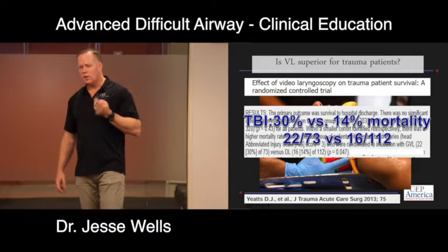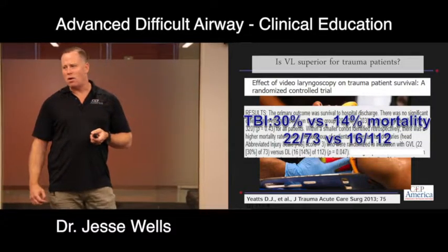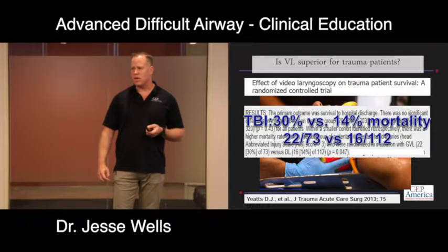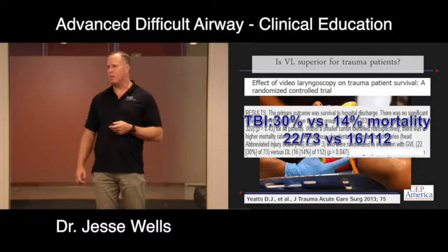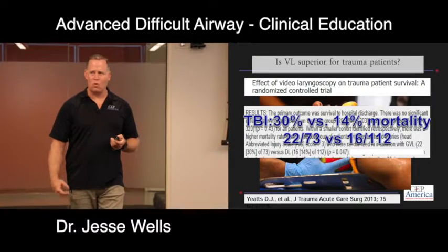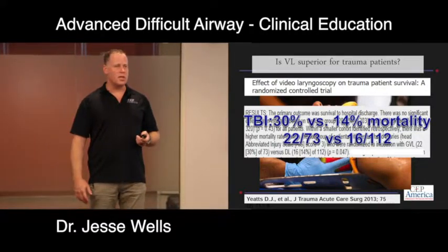All right, read the title of this article. This article is purporting to talk about whether or not patients live or die based on which type of technique is used for intubation. They compared direct laryngoscopy to video laryngoscopy, and they looked at death as the outcome. So, really, is it a big enough difference to cause death? Well, yeah, it turns out there is.